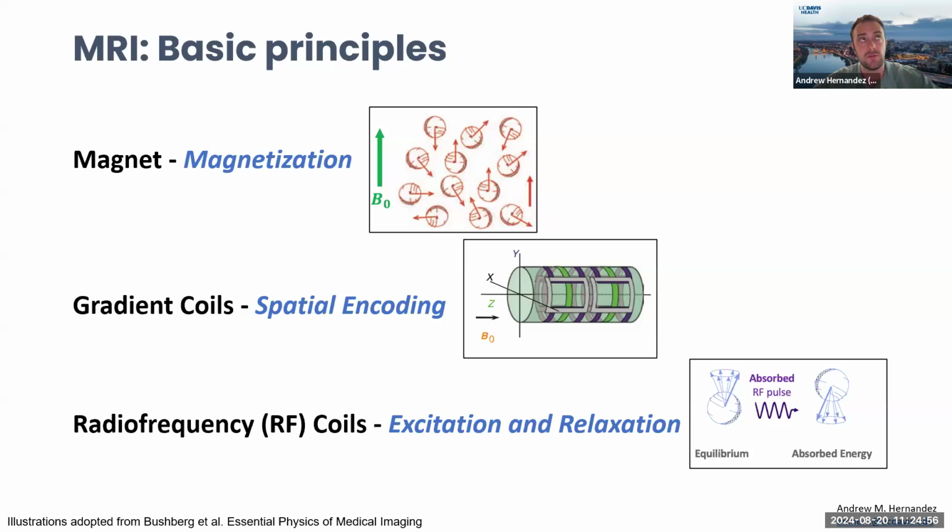Basically these principles are fundamental for producing MR images, and they really enable radiologists to differentiate different tissue types. However, each of these specific principles requires a significant amount of energy to provide the diagnostic quality expected of MR images. Next slide.